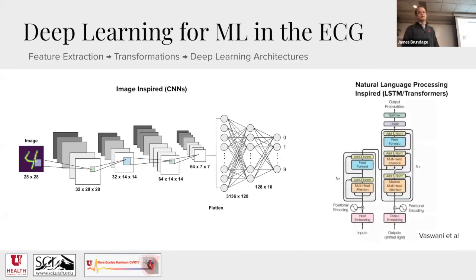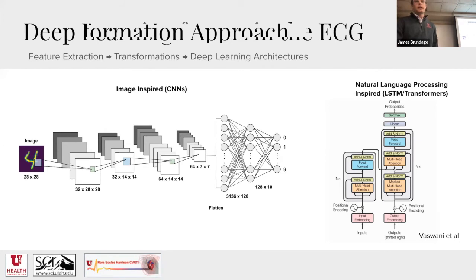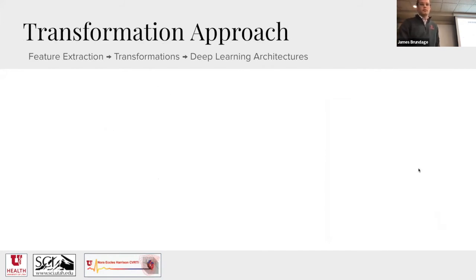And then also there's another subset of deep learning architectures inspired by time series, which when I first came in I thought intuitively had to be the best because they're time series models. This exists in the literature, but I would say it's still developing. LSTMs have been done. There's a few transformers, but transformers haven't really become the mainstay of this yet. So these are obviously really good for complex problems, lots and lots of data. They tend to be computationally more expensive, but yeah, they're interesting.